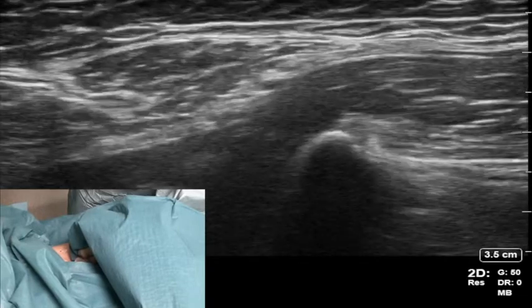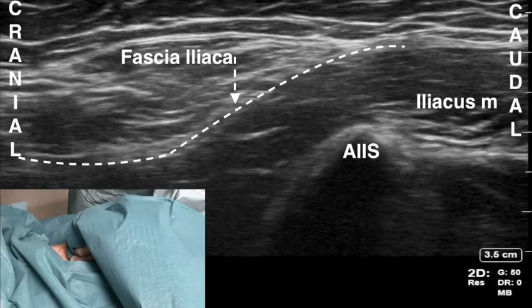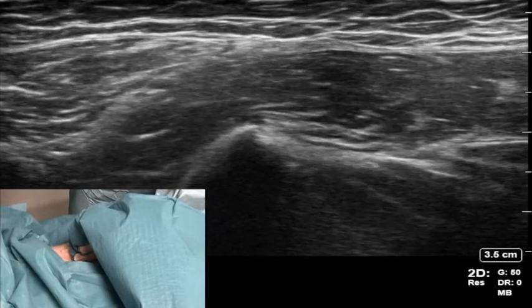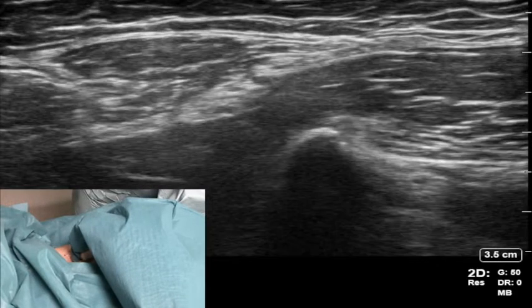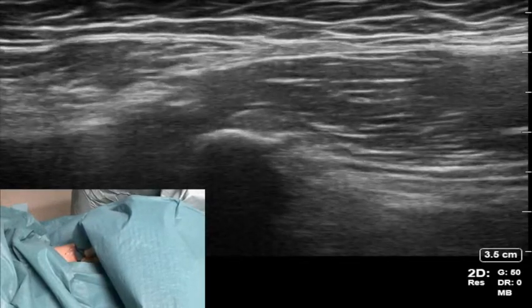At this point move the probe superiorly to see the iliacus muscle delving into the pelvis. Then make small adjustments to the probe to enhance the bright white line of the iliacus fascia. Make sure you scan the area using colour mode on the ultrasound machine to find any vessels that could potentially be in your needle path, as there are in this scan.